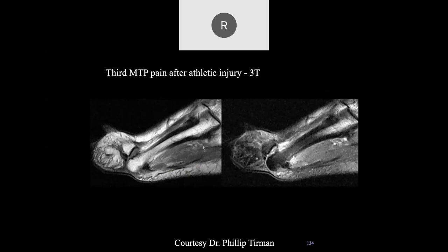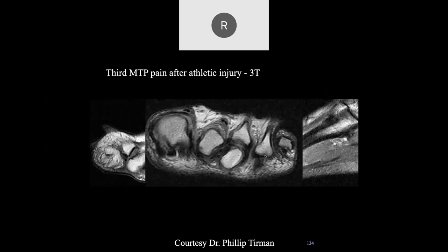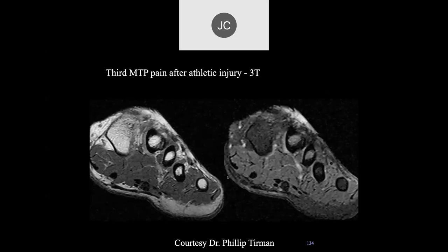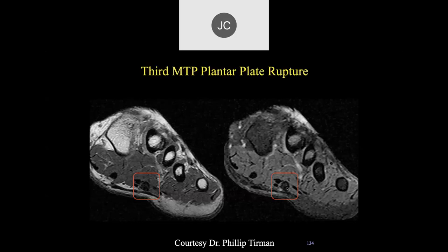Third MTP pain after athletic injury. There's a dorsal dislocation of the proximal phalanx relative to the metatarsal head. On coronal images it again looks dislocated. There's a rupture of the plantar plate at that level, and the flexor tendon is retracted and thickened and tendinotic.